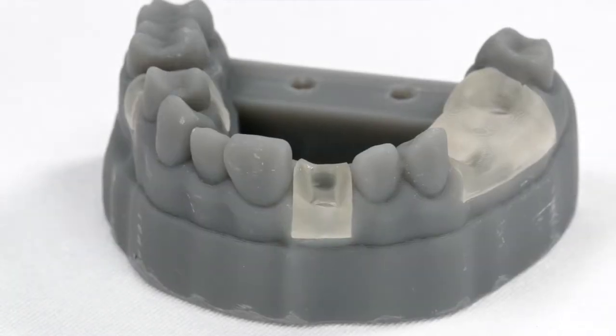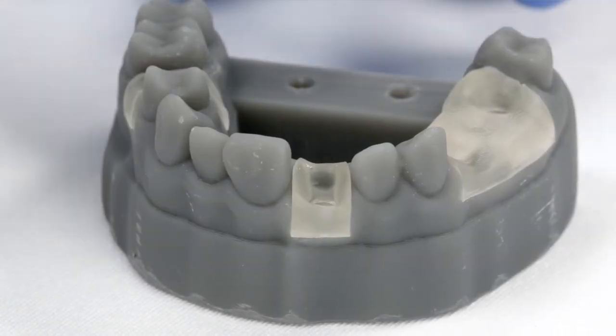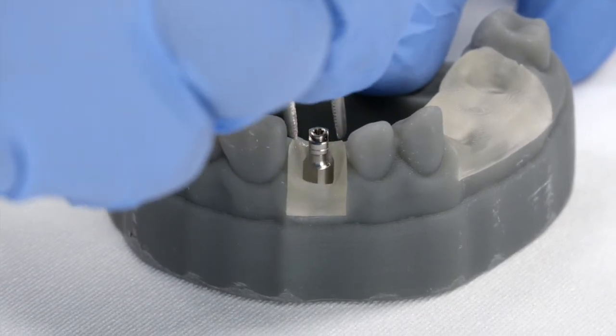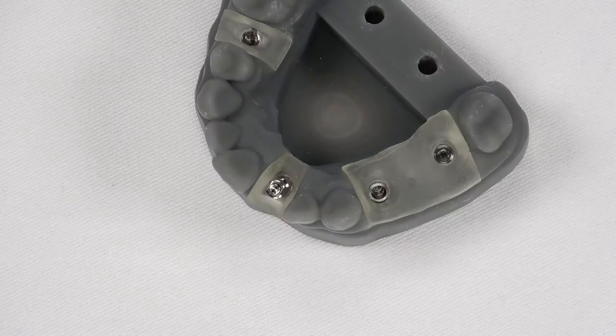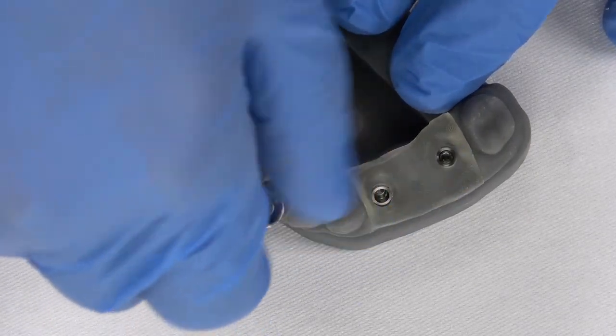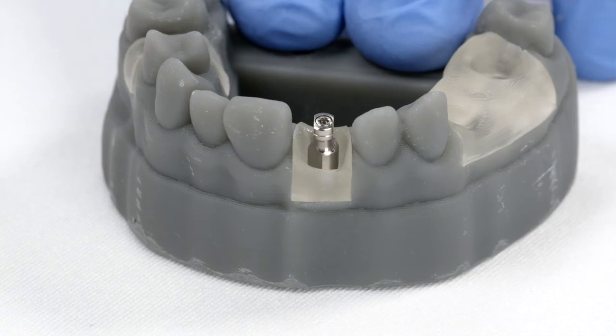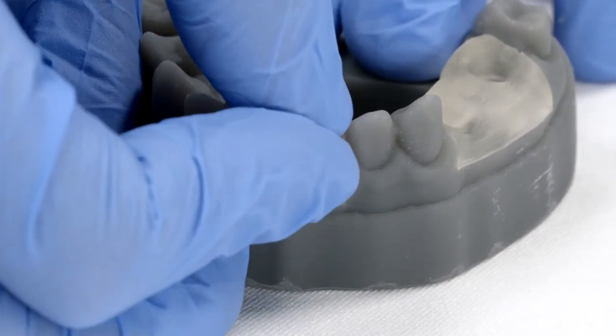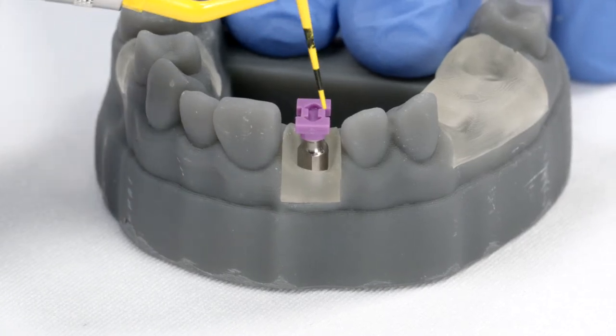It's time to show the different impression post options. Starting with the short closed tray post, screw all the way in. And now place the plastic cap on. Make sure that it doesn't have any interference with the adjacent teeth.